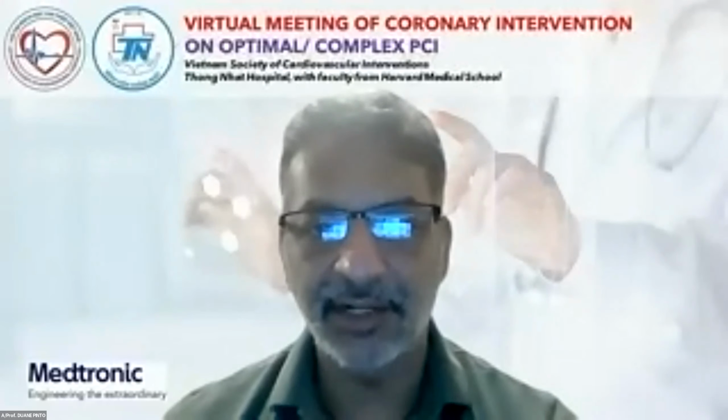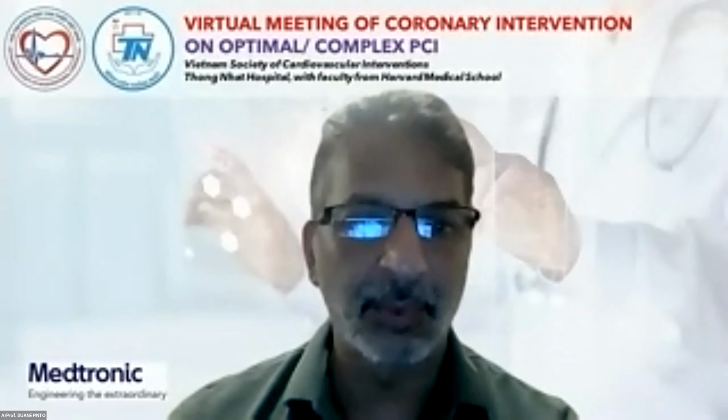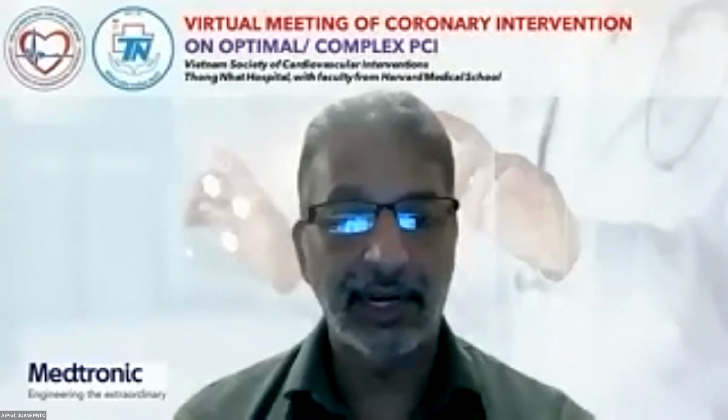So I don't know what the ejection fraction was in this case or whether the patient was compensated before, but you can see the extreme stress on the patient and the operators that happened when the patient's left main dissected. That would have been a very stable situation with an Impella in, and you would have had more time to think and to deal with the problem. Now, obviously this case turned out great, but I don't know that every single operator would be able to accomplish what was accomplished here.